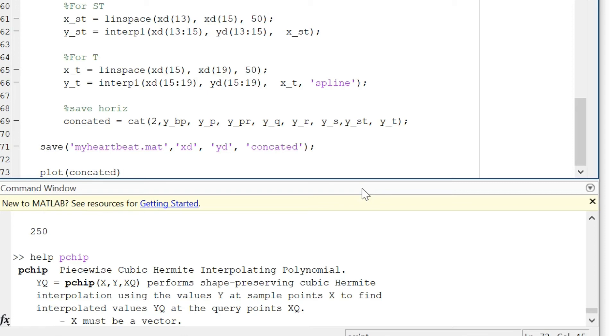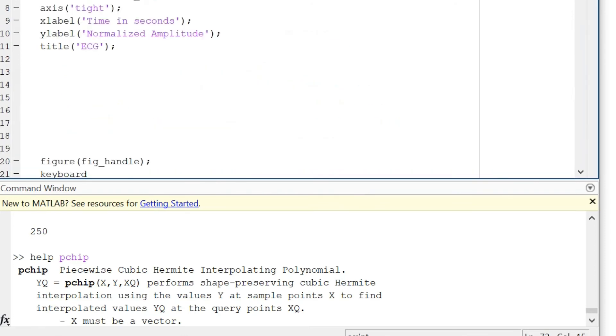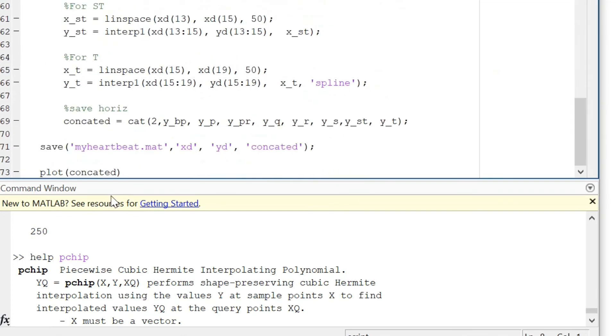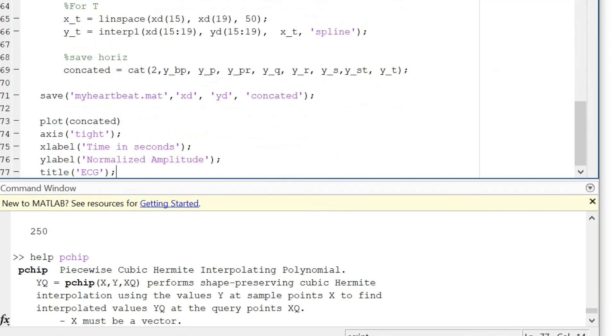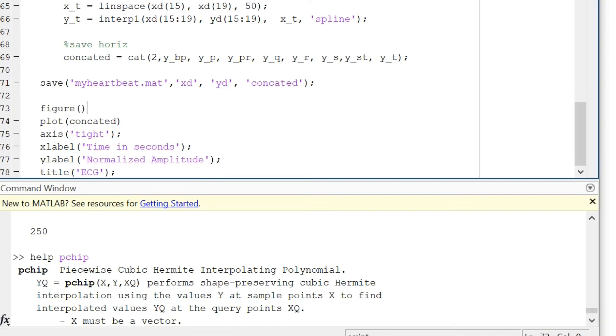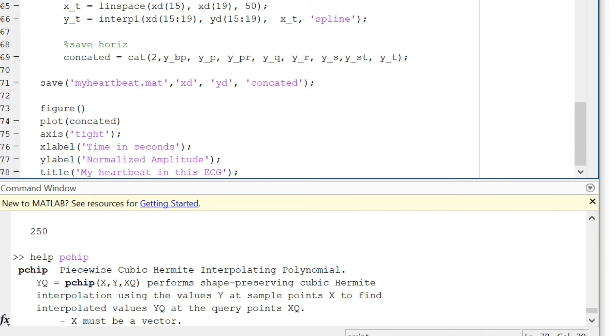Of course we can add the X label and Y label, so I can just copy it from here. This is just so that I create a new figure and I will write my heartbeat in this ECG.